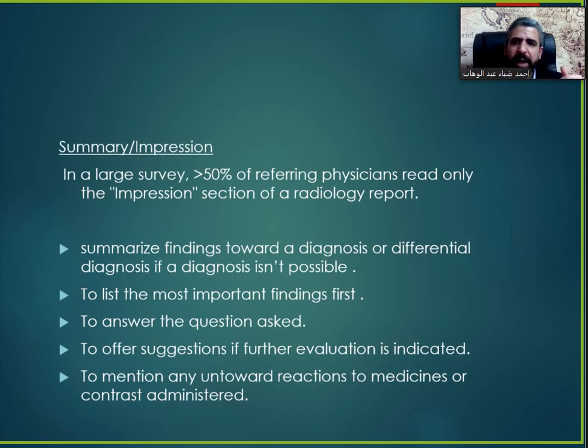After the body, we write the summary or the impression. Keep in mind that in a large survey, more than 50% of the referring physicians read only the impression of the radiology report. They don't read the rest. So this is a very important part of the radiology report. We should summarize the findings towards a diagnosis or a differential diagnosis if the diagnosis is not possible. Okay? And we have to list the most important findings first and answer the question asked. What's the question? This is the answer in the summary or impression.